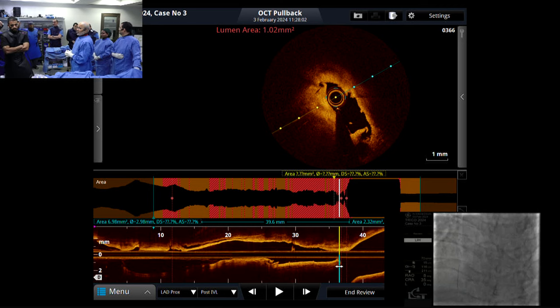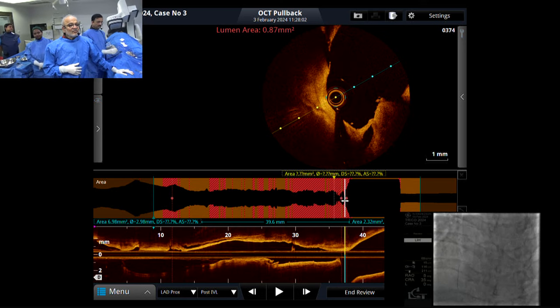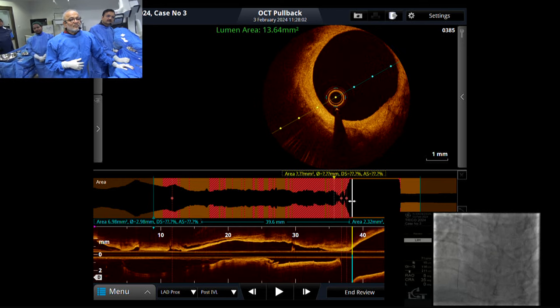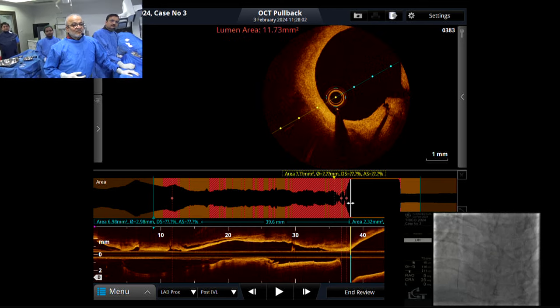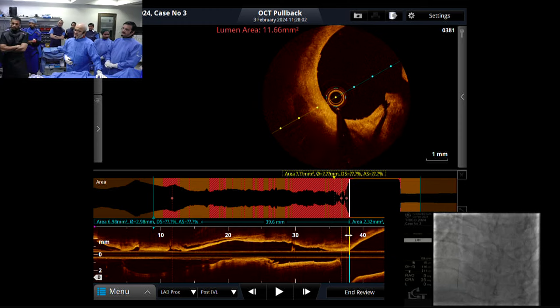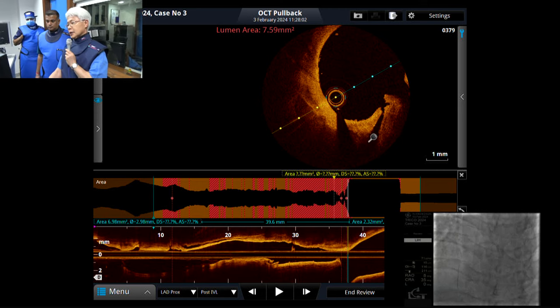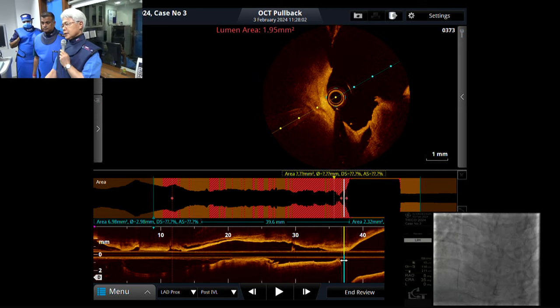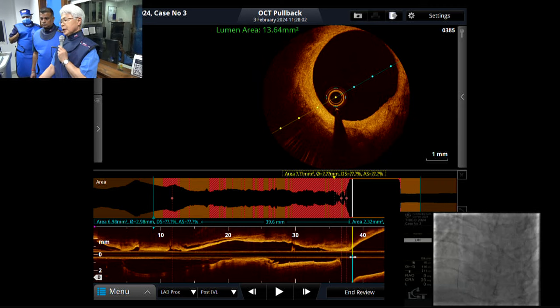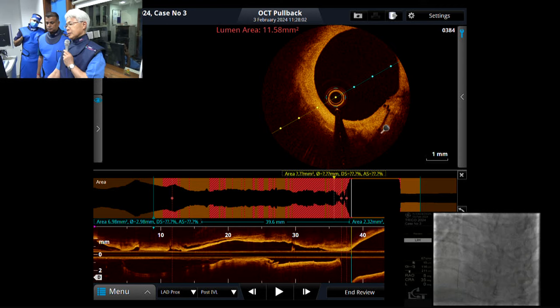Dr. Akasaka, if I may request you, the location of the nodule and its impact on the circumflex ostium post-stenting, and is there a dissection in the distal left main or just contrast? Your comment on that. Here in the distal left main we can identify the crack. Here is also the calcium, right? Calcium, crack. Yeah, here is a crack. Calcium is from here to here, right? So we can identify the crack. I think the left main is very huge and just distal left main should be okay. Only we can identify some crack here.